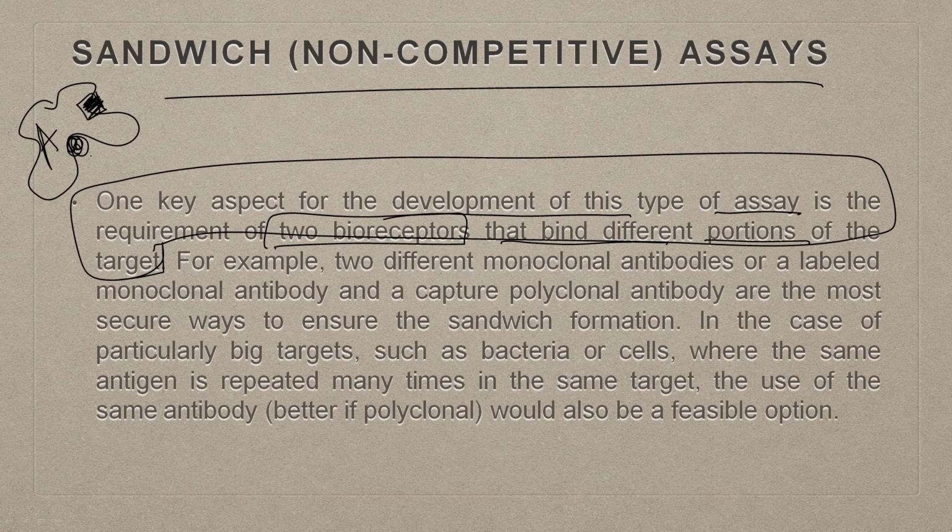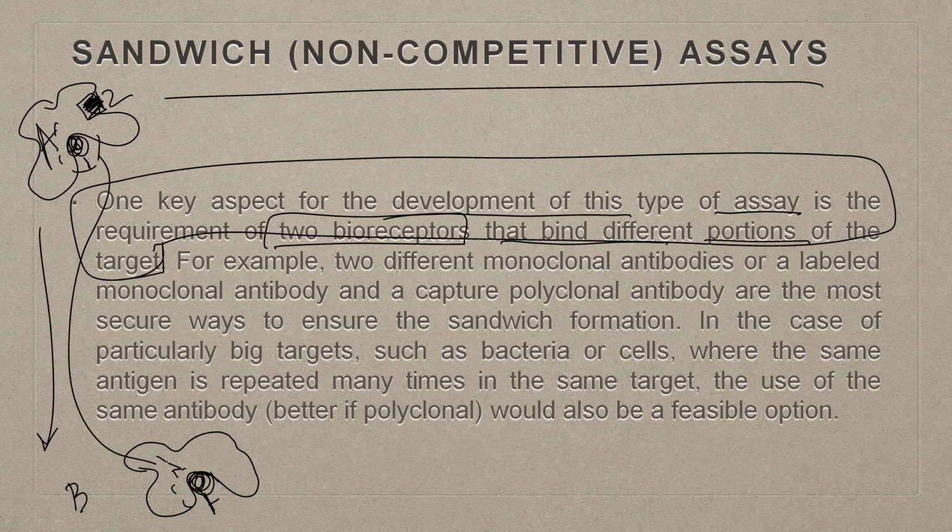Okay. There are 2 binding sites, binding site 1, binding site 2. Say for example, another molecule B, which is very similar in structure, except it has a very similar site out here. So, this site and this site are similar, but now you want to detect exclusively the A molecule, not B. So, what will happen if you only rely on this particular binding site? Then there is a possibility that there may be a false reading.